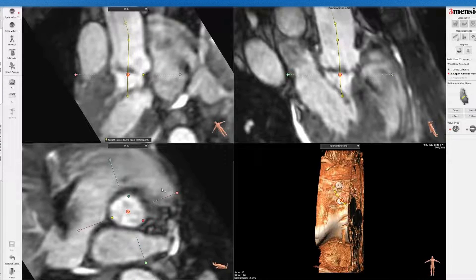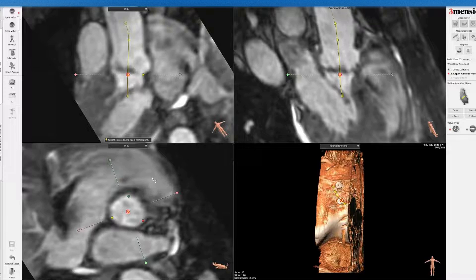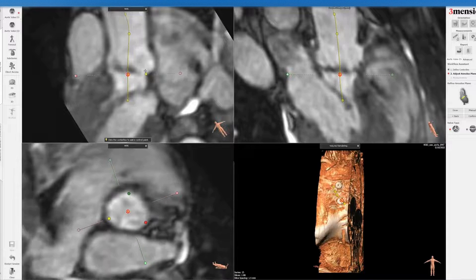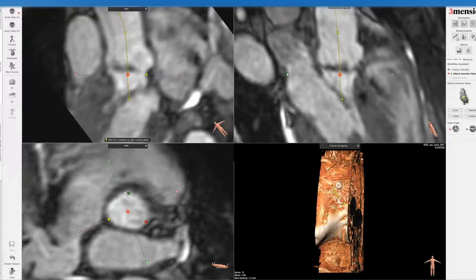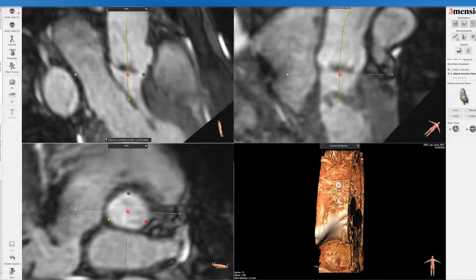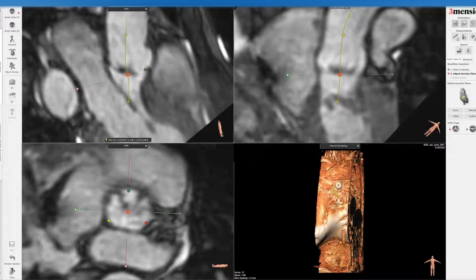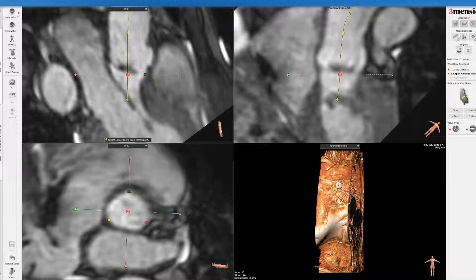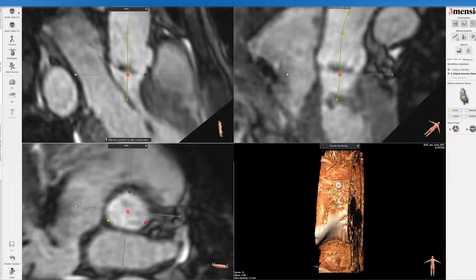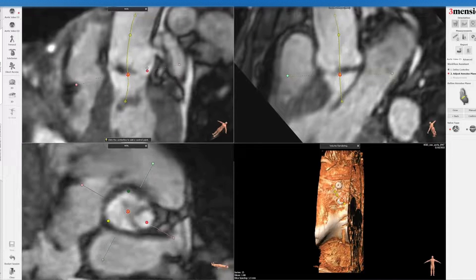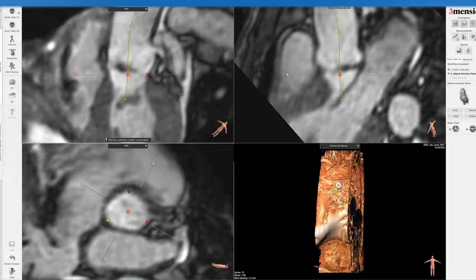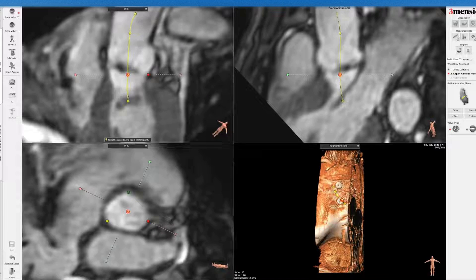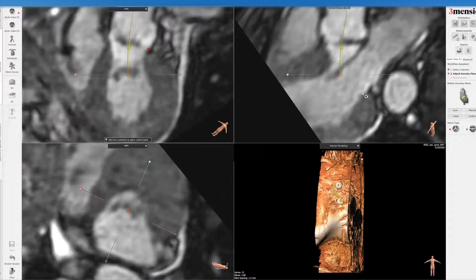Now let's fine-tune the annulus. You can actually drop or decrease the gain so that you can have a better delineation. You basically go up and down to where the sinuses converge into the base of the annulus. You can do the same thing on the right side — you can see how it converges here. Then the red dot as well comes up and converges, and then the LVOT — you can also make sure it's in the center.